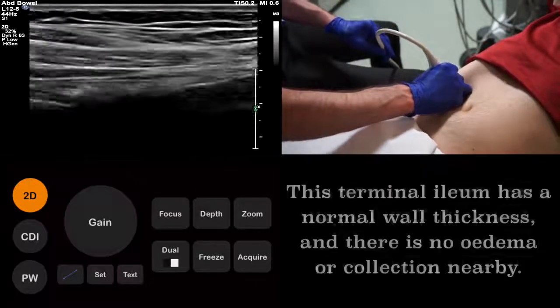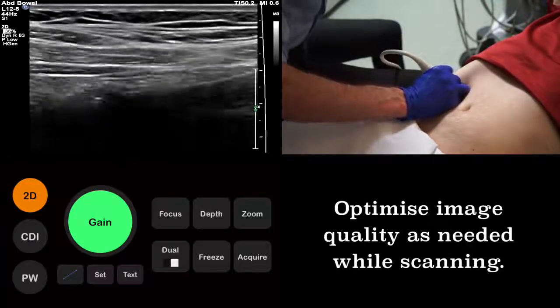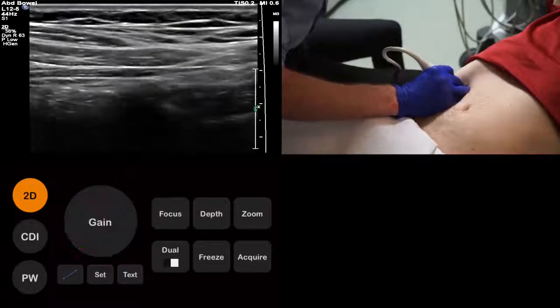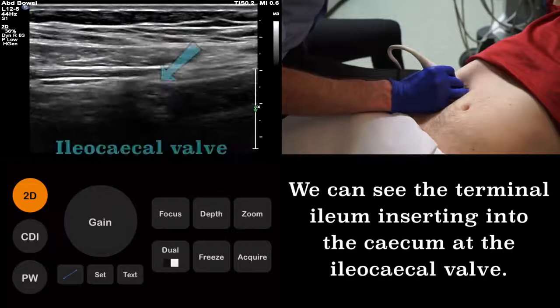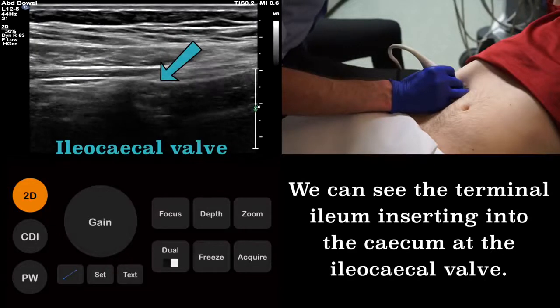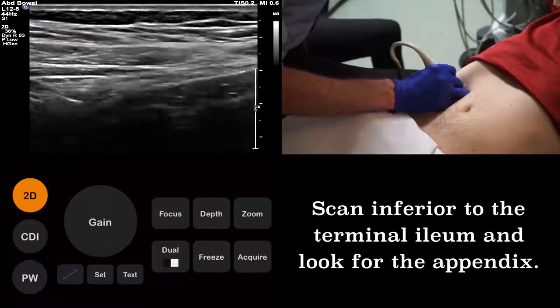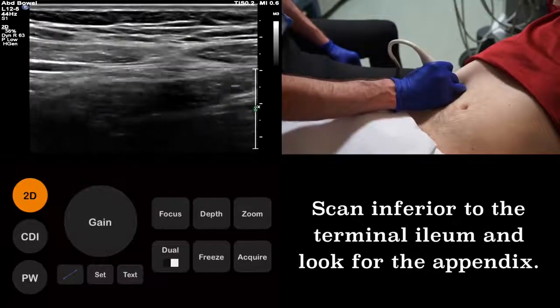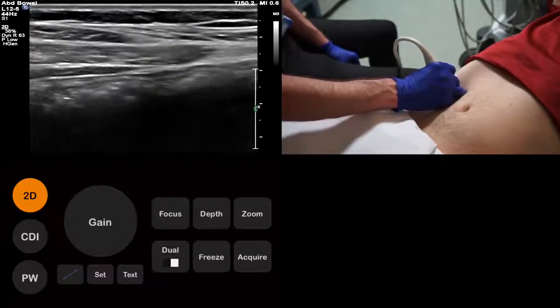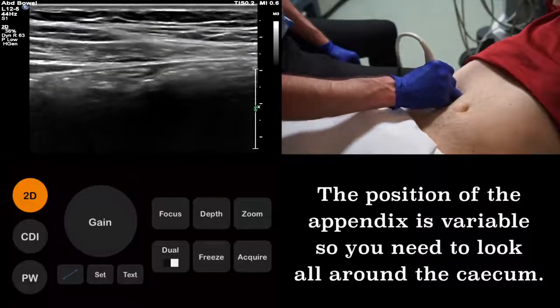We will now look closely for the ileocecal valve, taking time to optimise our image further using the gain control. This is an important landmark. The ileocecal valve defines the position of the cecum, so once we have found it we know that the appendix must arise nearby. Look carefully for a small blind-ending tubular structure. The position of the appendix varies from person to person, and therefore you need to look all around the cecum to be sure of finding it.